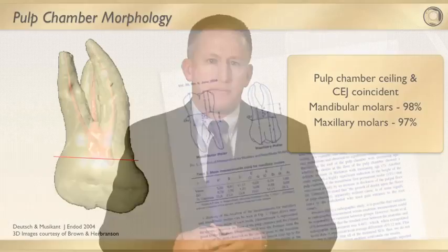With this information, each time we begin our access, each case we begin to treat endodontically, we know that we can confidently remove this tooth structure without the probability of damaging the tooth or ultimately creating a failure because of an iatrogenic perforation or indiscriminate removal of tooth structure. So understanding these concepts is crucial to proper endodontic access preparation in the posterior.